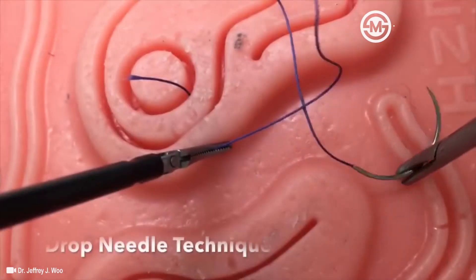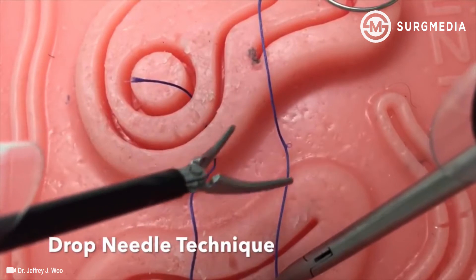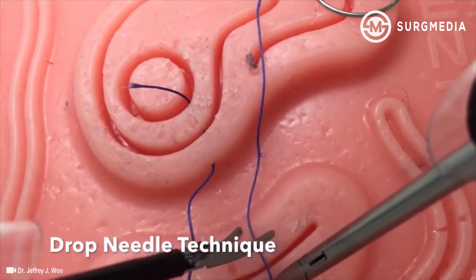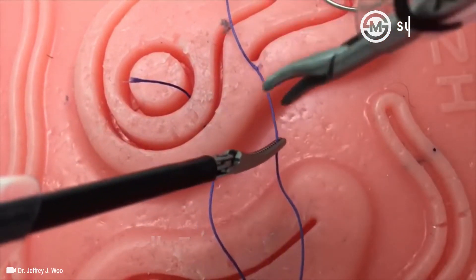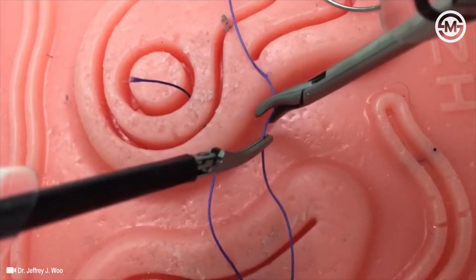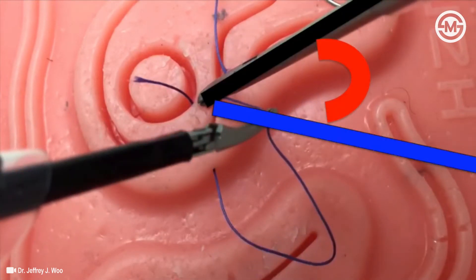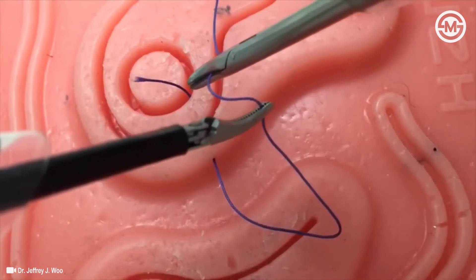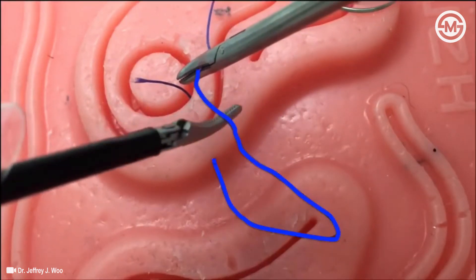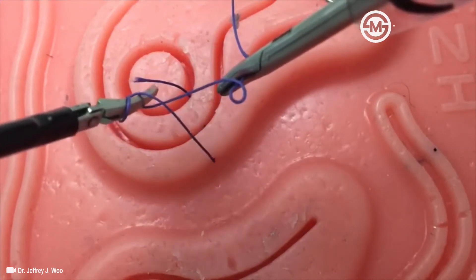This video will demonstrate two intracorporeal suturing techniques. The first one is the drop needle technique — the setup is key. First, create a long elongated U with the suture. By creating this elongated U, we are decreasing our instrument to suture angle, a key feature to intracorporeal suturing. Once the acute angle is created, place your left instrument inside the U and simply twist the suture twice around your instrument to create a surgeon's knot.